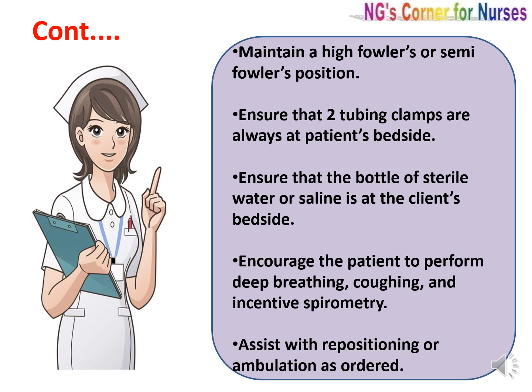Next, ensure that the bottle of sterile water or saline is at the client's bedside to refill the water seal and suction chamber as needed. Encourage the patient to perform deep breathing, coughing and incentive spirometry because it facilitates the drainage process and re-expansion of lung. Next, assist with repositioning or ambulation as ordered by the physician.